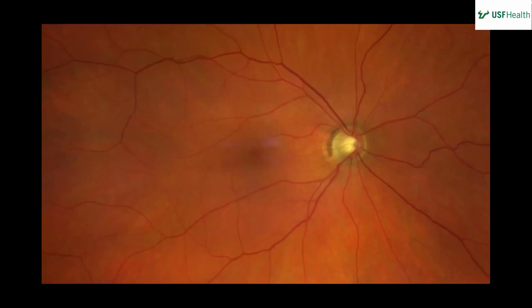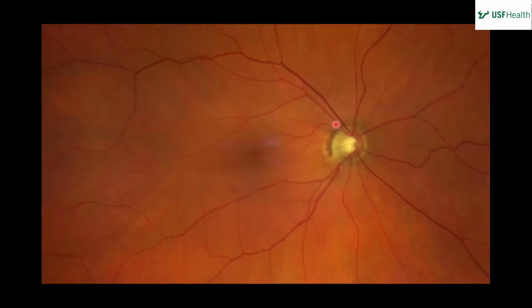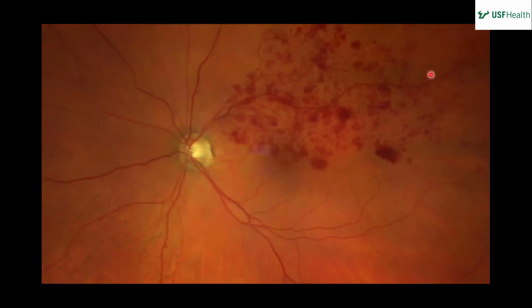Okay, so we have a color fundus photo of the right eye. Vitreous is clear. The nerve looks pretty sharp and flat. Some peripapillary atrophy, a nasal or temporal pigmented crescent. Pretty good foveal reflex. Not seeing anything grossly abnormal. I don't think they can see your pointer, but you can see his pointer. Okay, but you can point. I'll try to follow what you're talking about.